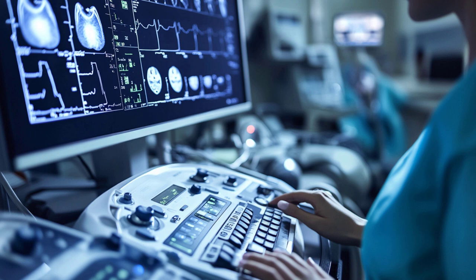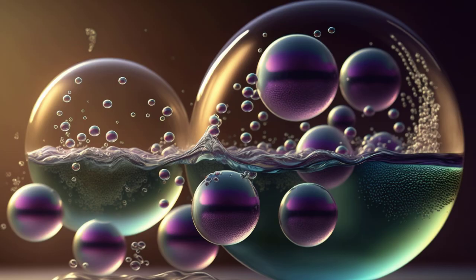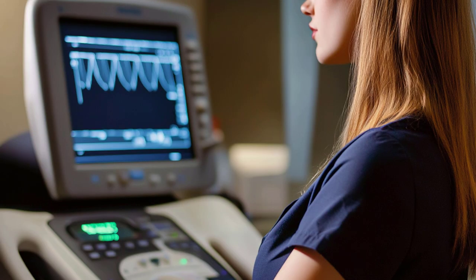A typical example involves lipid-based shells, which are favored because they mimic the natural cell membranes found in the human body. One might ask, why not leave the bubble uncoated? Without a protective shell, the gas would escape almost instantly, rendering the microbubble useless for imaging. Picture wrapping a delicate object in bubble wrap. Without it, the object would be damaged. But with it, the object is protected and secure.